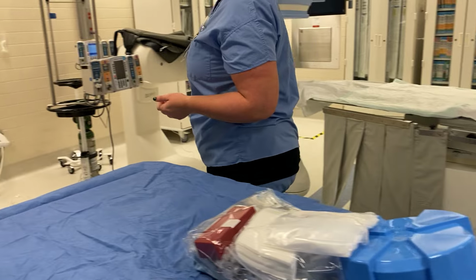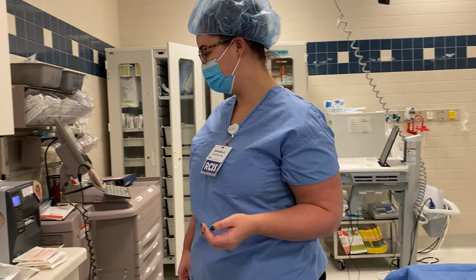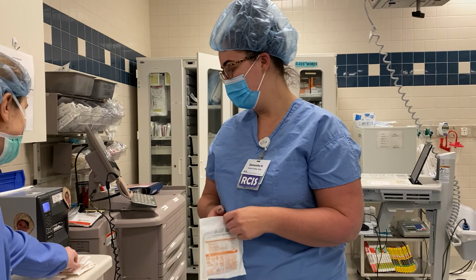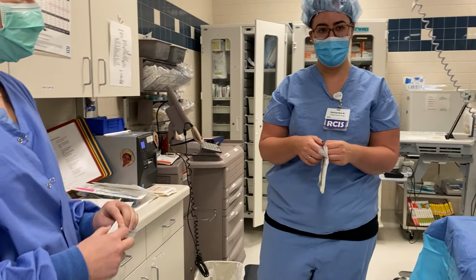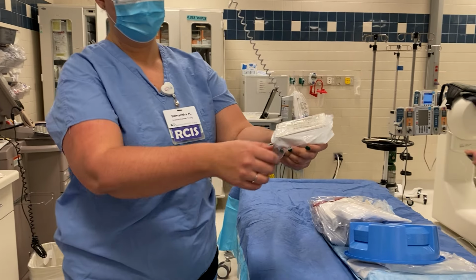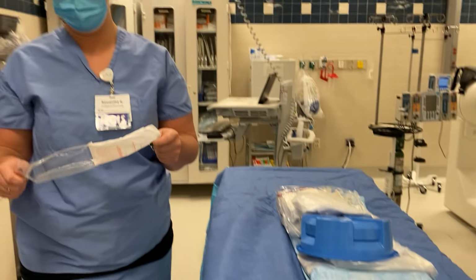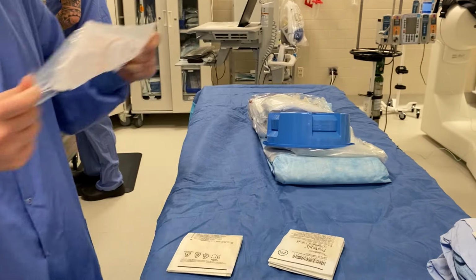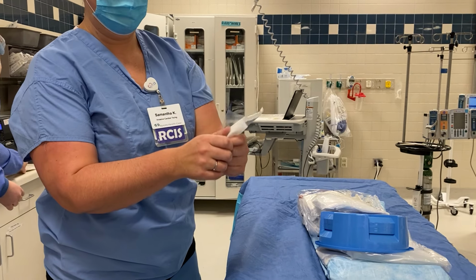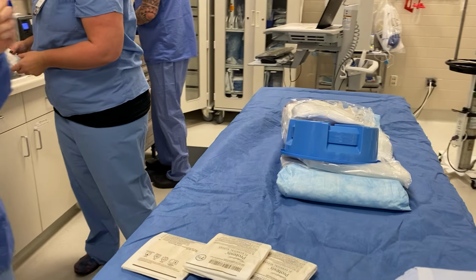Now, my friends here are going to help us start to open some of the other supplies that we need for our table. So we have our sterile gloves here. And so the best way to open anything aseptically onto our table is to hold everything on top of your arm, hold it over the table, and just peel apart so that it drops. And before we scrub in to set up the table, we're going to open everything that we can.